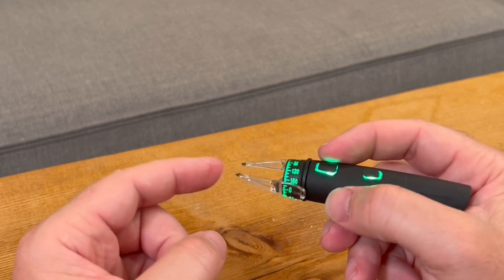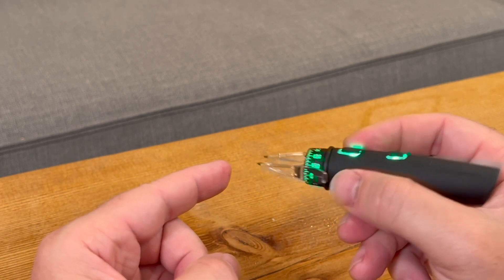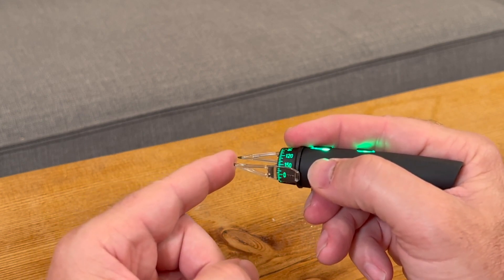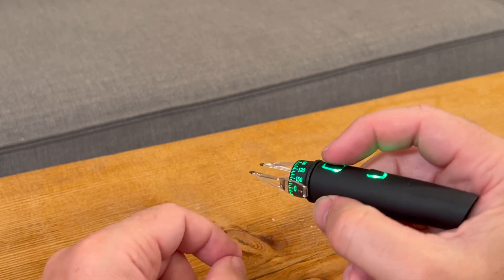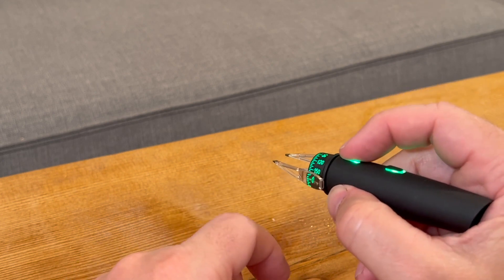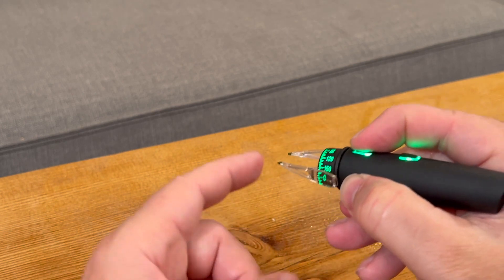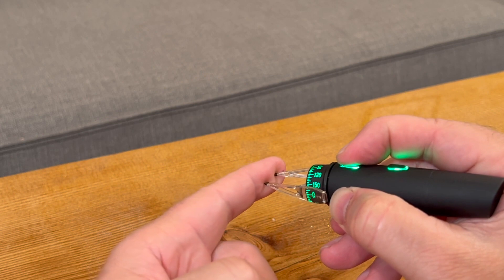An issue with the original Robomarker was that if you happened to contact the cornea asymmetrically, the Robomarker would pivot, so you'd have to hold your finger on the front of it. But now with the G2 Robomarker there's a fix for this. If you push on the front button, it hits a little brake. So once you push that button, if you contact the eye a little asymmetrically, the Robomarker is not going to pirouette. You can see how it holds its position as you rotate it.